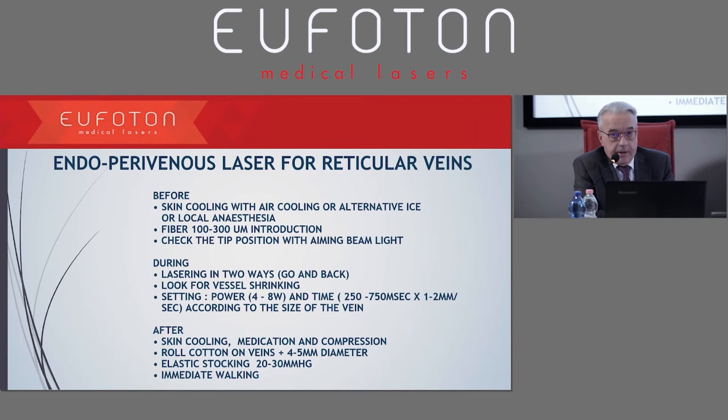Once we insert the fiber, we go back and forth with the movement until we see the telangiectasias disappearing. So the power is clearly different. We're going from 3 to 6 watts with an exposure time of 250 to 750 milliseconds per millimeter.